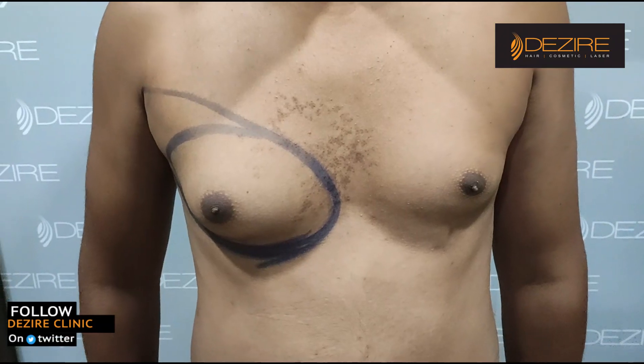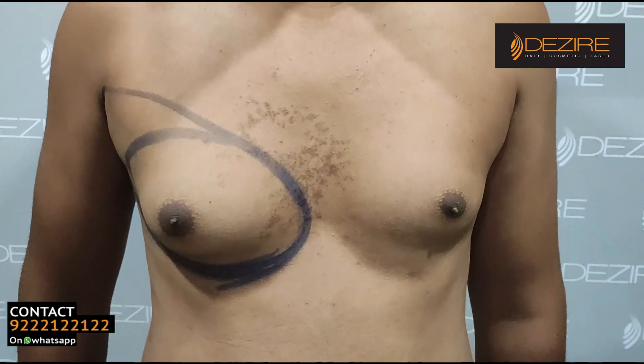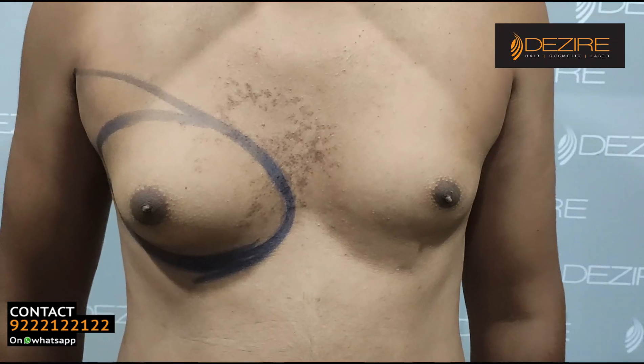From the beginning you can see a lot of fat from one side. Yes, now there is a lot of fat. The two sides were originally normal.